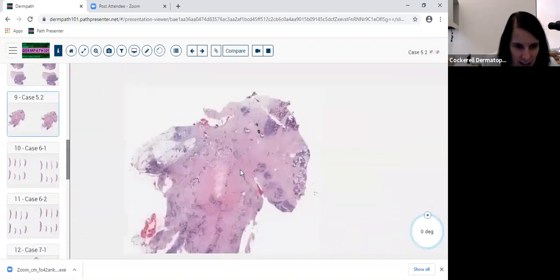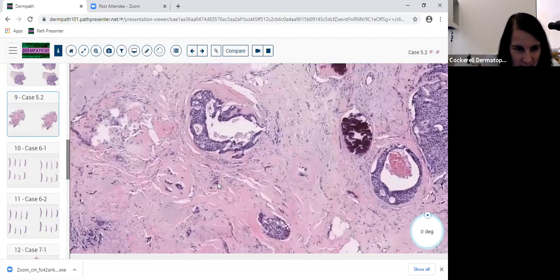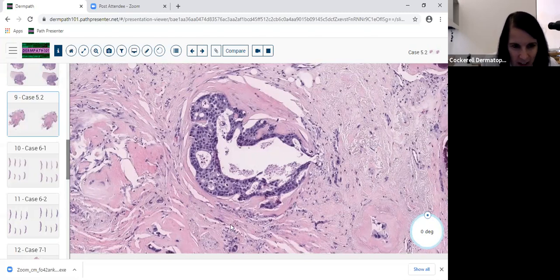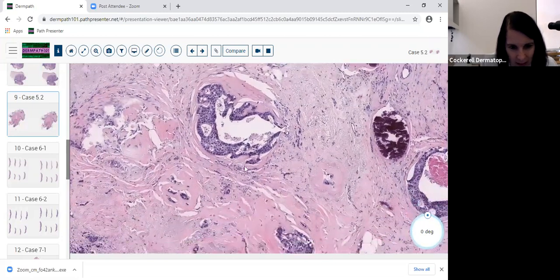This is another slide of the same case. When you start to see this cribriforming area and these calcifications, it's very reminiscent of breast because this looks almost intraductal, but there's no myoepithelial layer. So this is an invasive cribriform nest or group or island. So if you look at this tumor and you look at that area, that looks like breast for sure. Because it looks like in situ breast, but it's not.